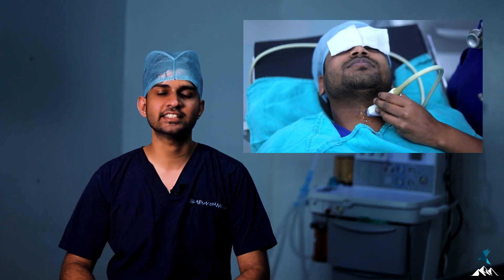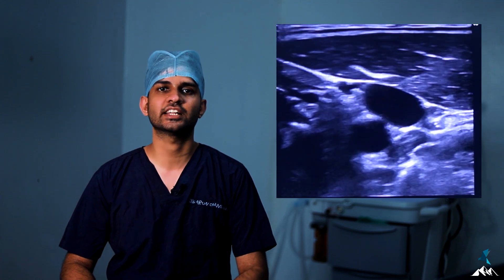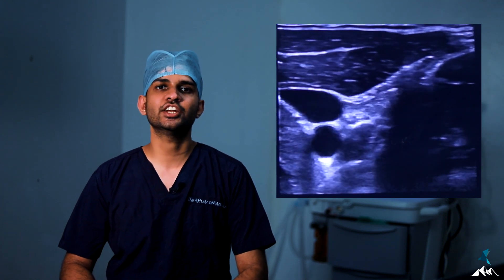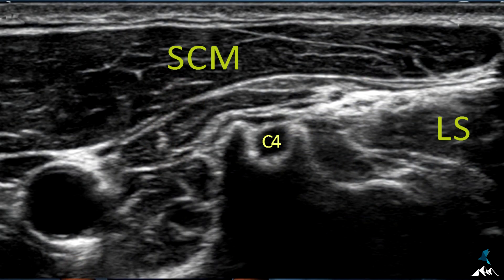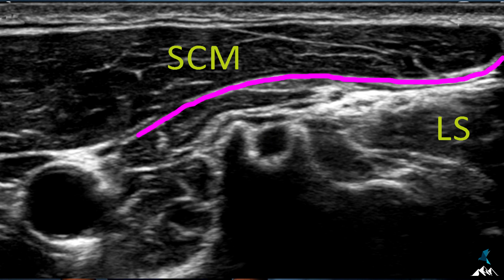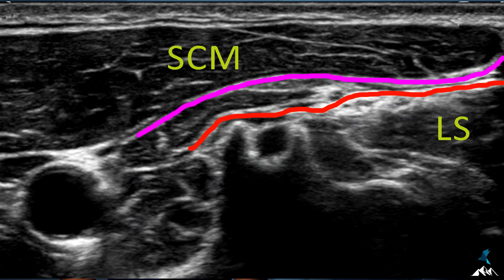We start from the midline at the level of the thyroid notch — the C4 level — and move laterally. As we move laterally, we can see the internal jugular vein and the carotid artery, and further laterally we see the sternocleidomastoid muscle. The area of interest is the lateral end of the sternocleidomastoid muscle. We need to visualize the levator scapulae and middle scalene muscle. Just posterior to the sternocleidomastoid is the investing layer of deep cervical fascia, and just superficial to the levator scapulae and middle scalene is the prevertebral or perivertebral layer.